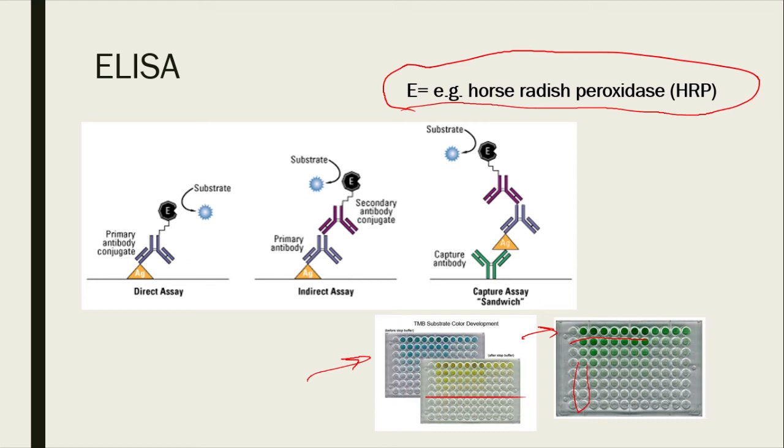Okay, now going back to the basic principles of what's happening with ELISA. Again, you need your antigens, represented by Ag here. Now, this antigen needs to be fixed in some way. It could be just stuck on the plastic. Well, wait a second, Dr. Han, did you say the protein will just stick on a plastic?